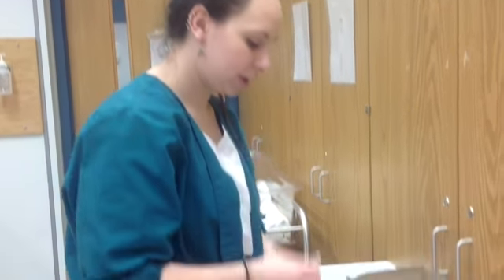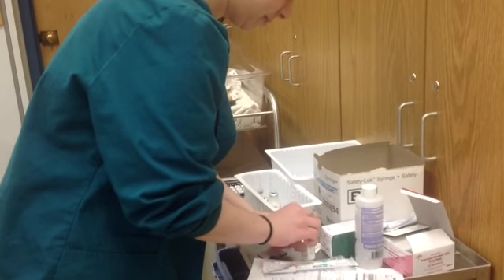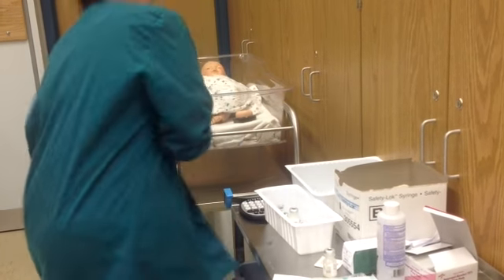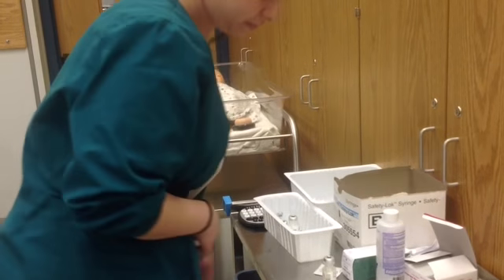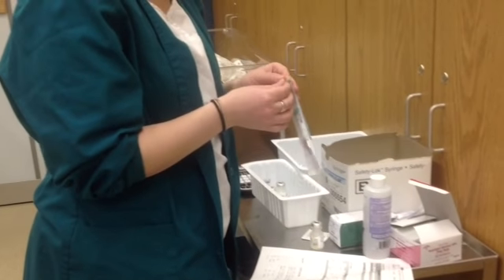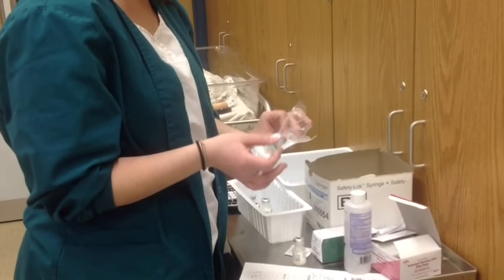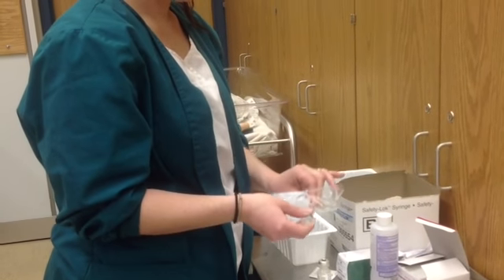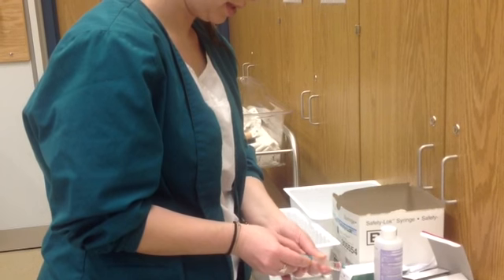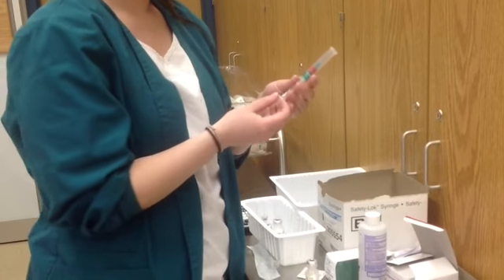First thing you're going to do is clean the top of the vial with an alcohol swab. Okay. And then you're going to throw this in the trash. There's usually one on the side of your med cart. So then I'm going to open up the syringe. I'm just going to take the cap off, keep the needle facing away from you. I'm going to pull up the safety a little bit first, because first thing I want to do is draw air into the syringe.